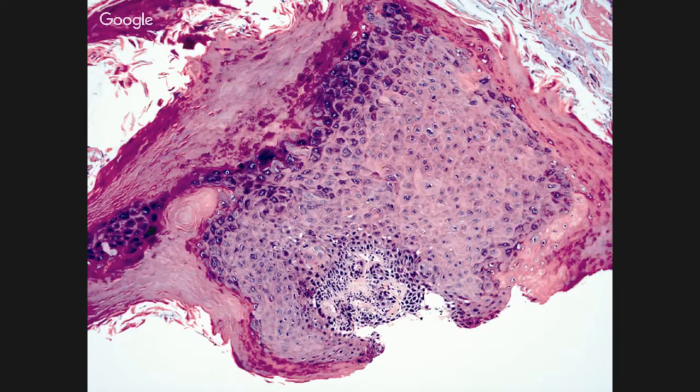So these biopsies of the upper airway in keratinizing lesions that are hyperplastic and dysplastic, when the surgeon takes a biopsy, they may think they're giving us a lot of tissue. But here's an example in which there's very little stroma, very little. And in the absence of stroma, it becomes impossible for us to determine if there's invasion or not. Generally, if there's invasion, the cancer will anchor to the stroma, so a biopsy won't be a neat cleavage plane of the epithelium.